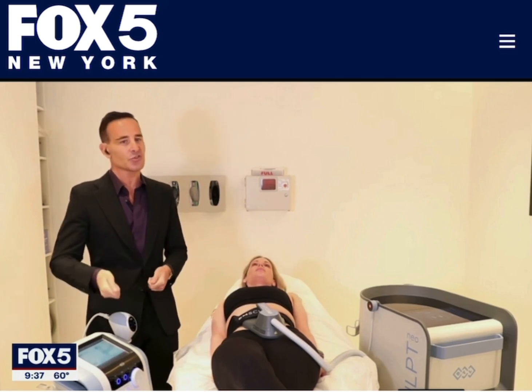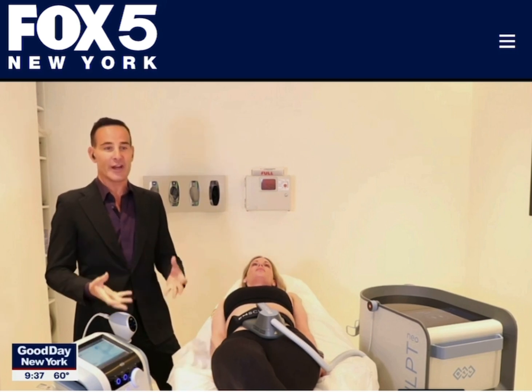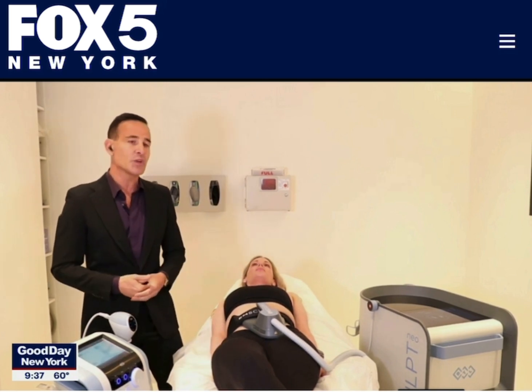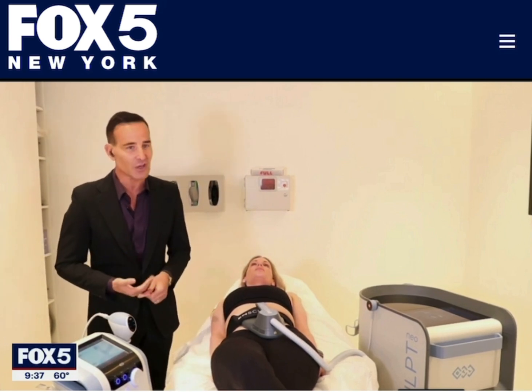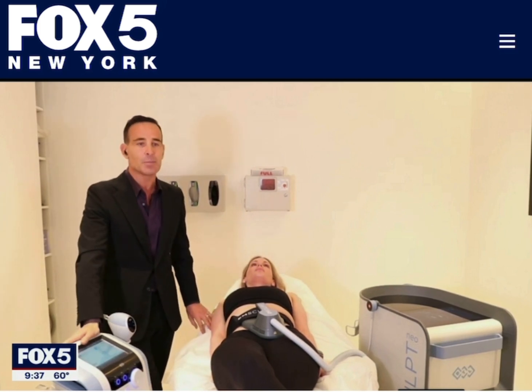Are there any risks to this? Well, you know, like with any medical device, most importantly, it's who's doing it. It's not just turning a machine on and off. I call the people who use these devices my registered nurses. They're kind of medical trainers. And what they do is they stand by you with the machines to increase the intensity as we go along, to really maximize the result that you get. But absolutely, just like when you work out, you could hurt yourself. You could pull muscles. You could strain the back, cause sciatica, cause burns. So this really needs to be done in a medical environment by a medical professional.